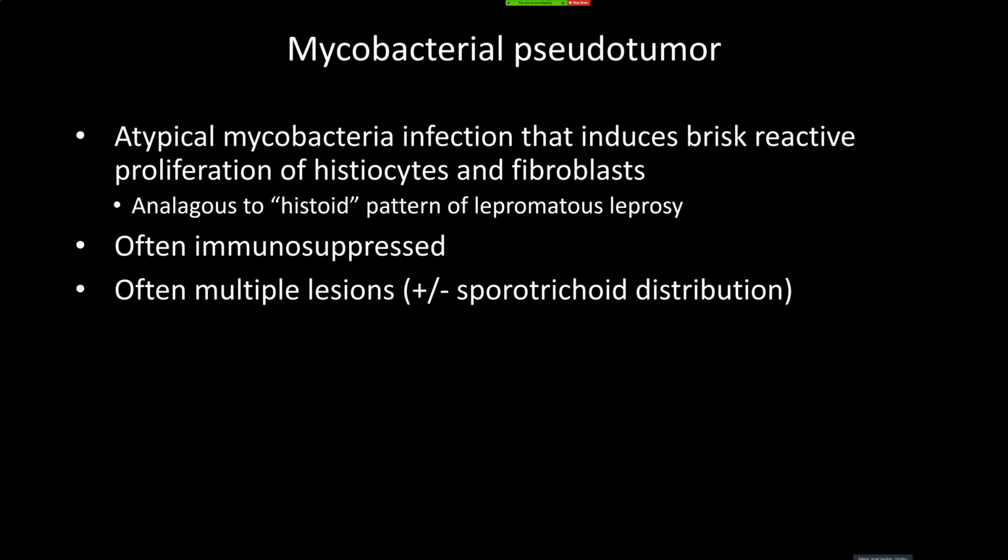The other thing that I had on my differential was actually, I've seen a granulomatous bee sting reaction. Oh, really? Wow. Yeah. And it was very lymphocytic. It was lymphohistiocytic like that. That's amazing. So it's the same kind of process, right? Where it's an exuberant reactive process that produces all of these, the spindly stuff that's growing there, which is unusual, right? Usually we see a lot of inflammation without fibrohistiocytic response, but when we see that, it can really cause us to struggle and start thinking about tumors and stuff. So that's really fascinating about the bee sting. I'd love to see an example of that one day.